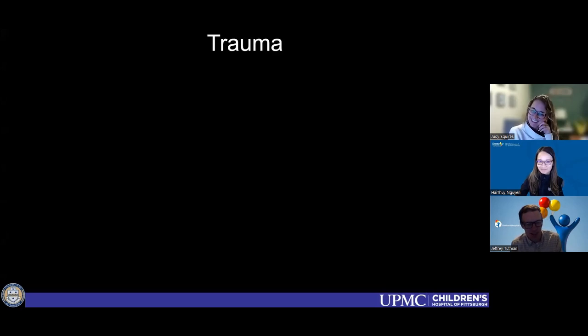I just have a question for you. Are you exclusively using contrast enhanced ultrasound for liver lesions for characterization, or are you ever using it for following lesions? We've had a couple of scenarios where our oncologists have asked us to use kind of serial contrast ultrasound to follow. In this particular case, I'm thinking of it was an FNH-like lesion, and we did several contrast ultrasounds on the same lesion. Do you ever do that, or do you just use it for characterization and then follow it with probably just grayscale ultrasound?